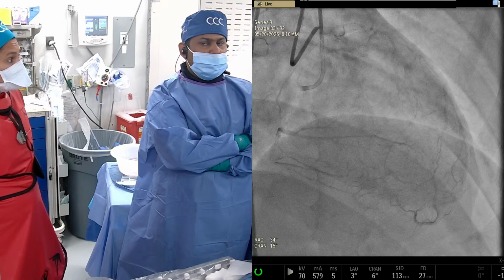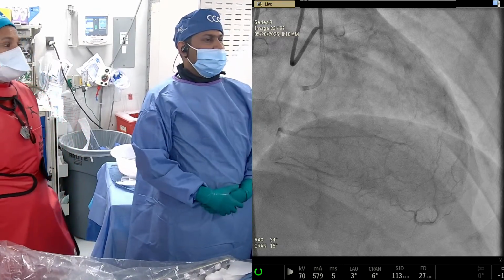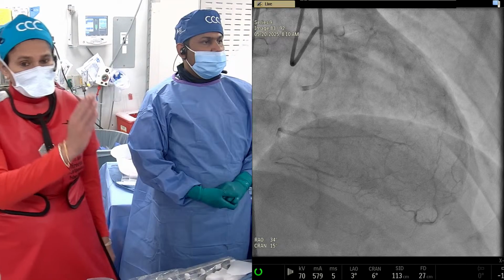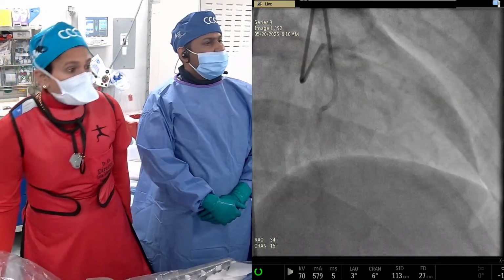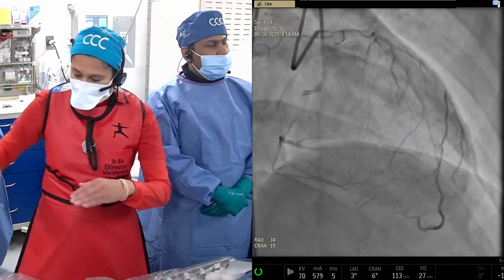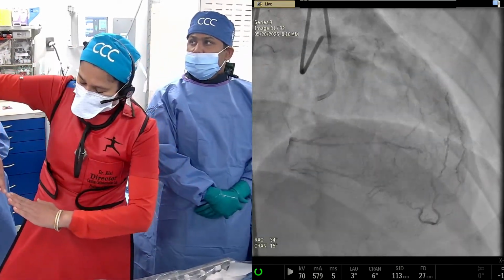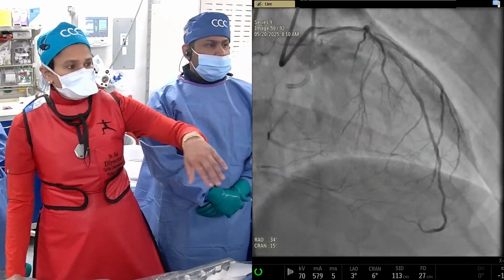Now anybody wants to use Turnpike or whatever they have, that's okay. Now why Corsair or not FineCross? Because you need something that you're able to torque turn, so you can navigate through the septal. Usually the most difficult part is the septal at the lower part of the septum, because there it's making a acute turn. Septal of the LAD, then you have a meeting with the septal of the RCA. That acute turn, always you have issues. That's exactly what we also showed.